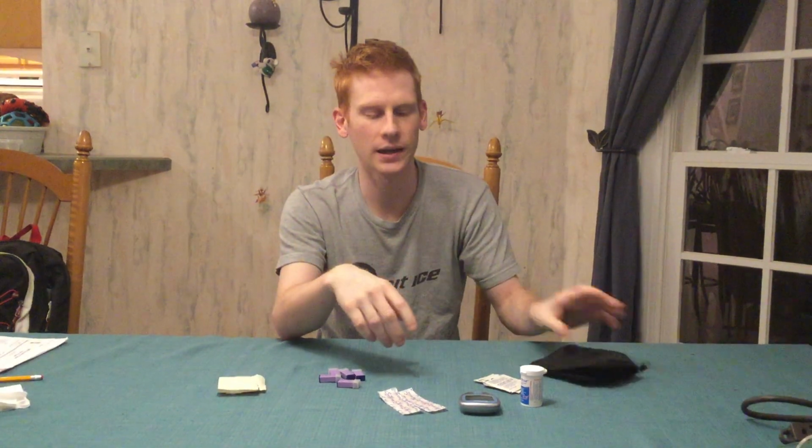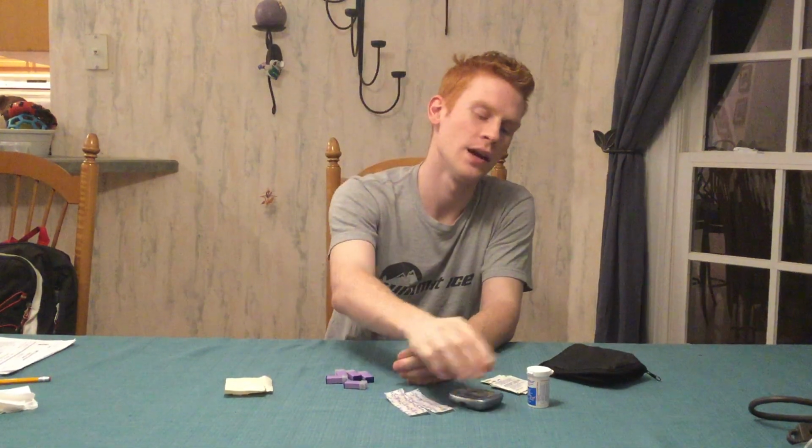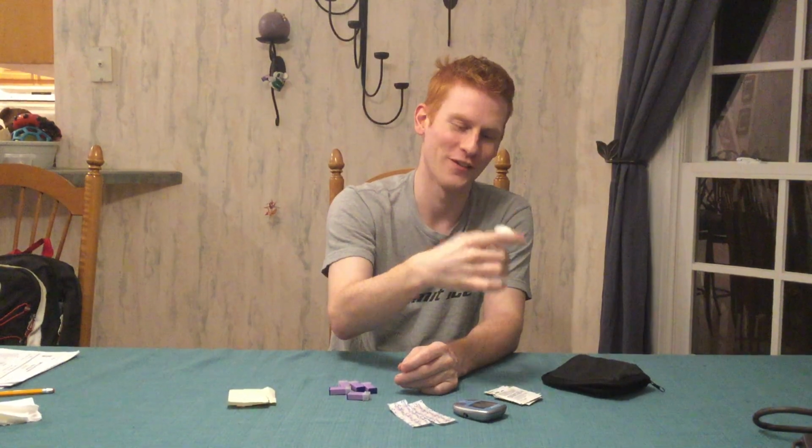There's like a little glucometer bag in your jump bag. There's multiple components. There's the glucometer itself, and every glucometer where you work is different, so make sure you're familiar with that. But these are the ones we use in the EMT class. All glucometers come with strips, and strips have an expiration date. So every time you check in on your shift, you always check the expiration date. And by golly, these expire in 2 days, so we're still in, it says the 31st, 2020.